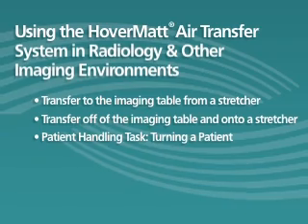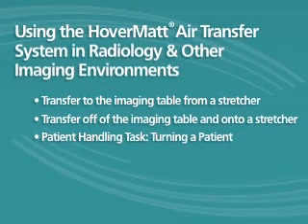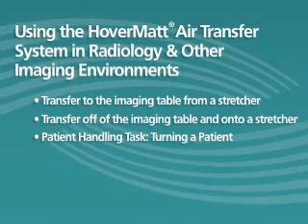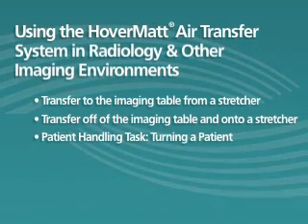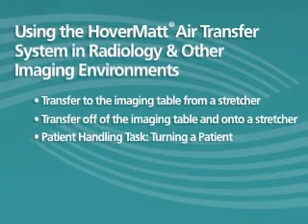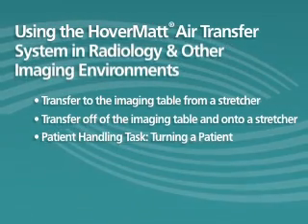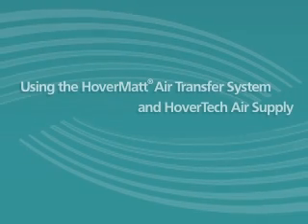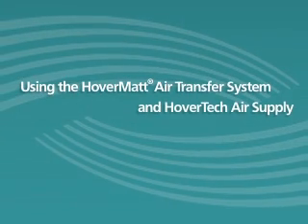This technique can be used in any hospital department to position a patient onto his or her side. For training purposes, we will use the example of turning the patient to position for a cross-lateral X-ray. We'll also discuss the use of the HoverMatt in the MRI environment. This segment will show the use of the HoverMatt.